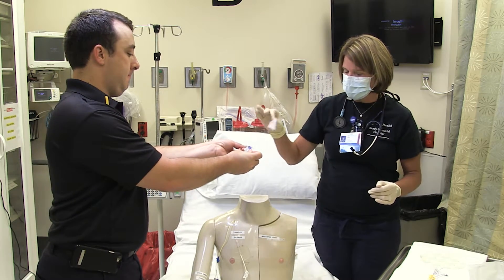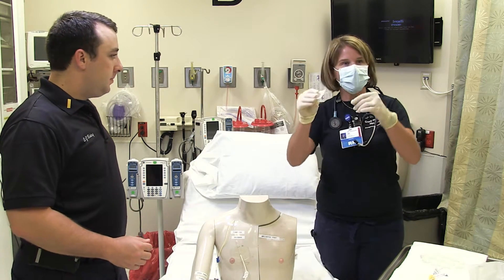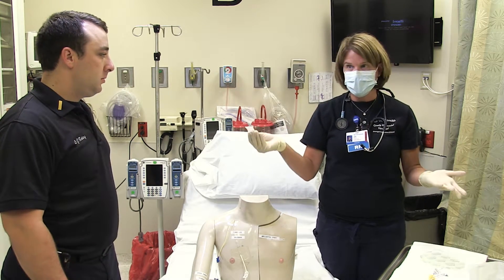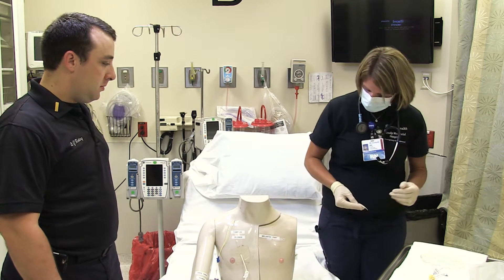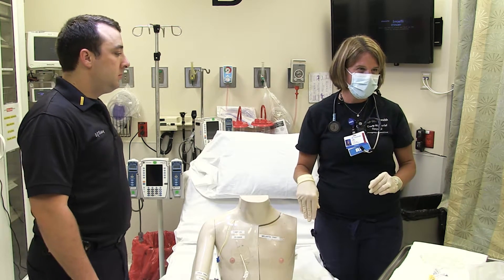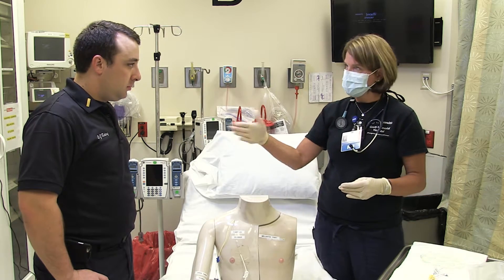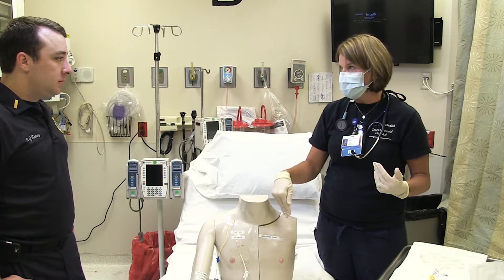Once it dries — we'll fast forward, it's dry now. He opened the alcohol swab and I grabbed only this, staying sterile. If I picked up that alcohol swab and opened it myself, I'm not sterile anymore. You're going to take this swab and just one time wipe it off. If you're only doing chlorhexidine, you really don't have to do the alcohol — that's only if you're doing betadine; you do one swipe across to clean it. The patient needs to keep their head turned away because we have bacteria in our mouths — they'd be breathing that right on it.